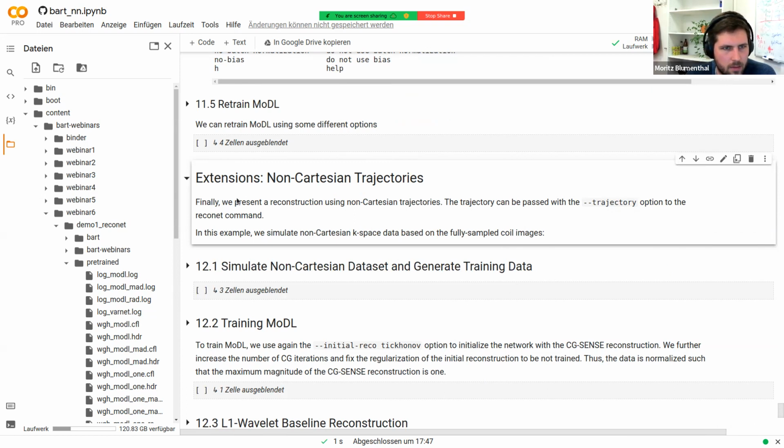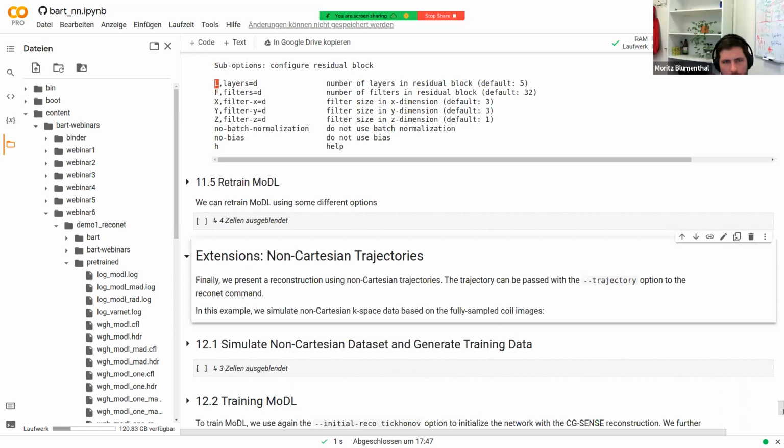One question was, does normalization work for the volume when you showed normalization? And if I understand, the question is, if you have a volume of data, can you normalize the full volume? Currently not. I think it's an interesting question. If you have a 3D k-space, then it should do that.